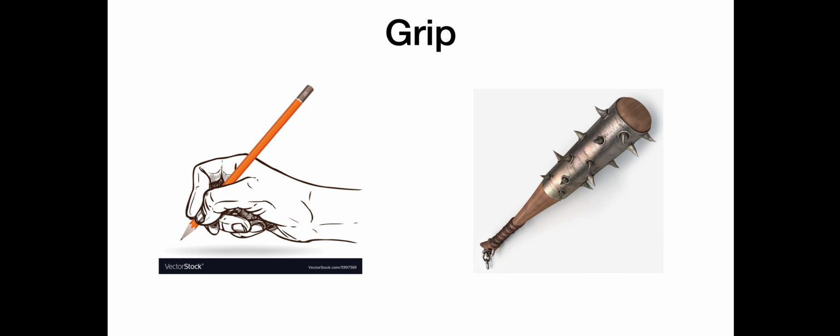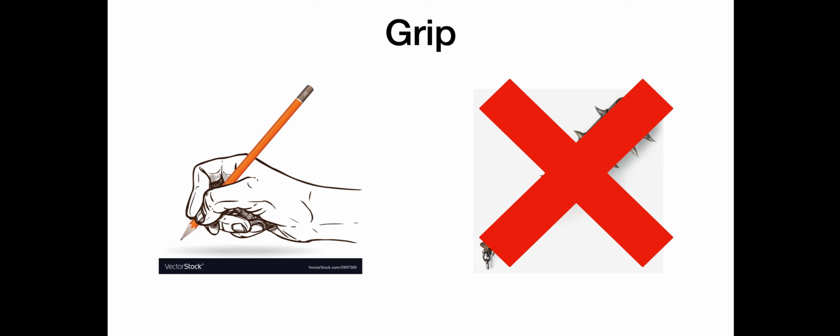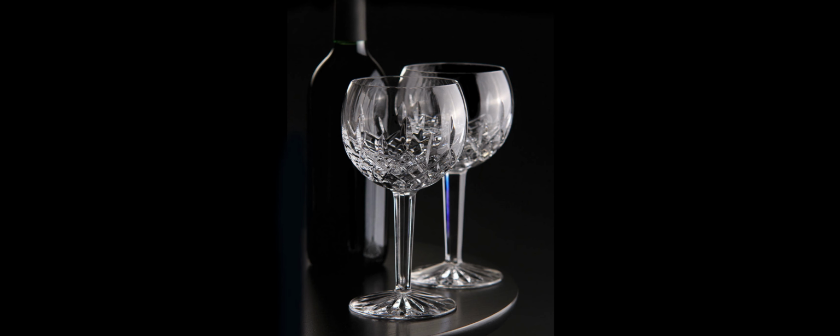When you're holding the transducer, it's much, much better to hold it delicately between your fingers, a little bit like a pencil, so that you can do very fine movements, as windows are sometimes a little bit challenging. Holding it between the palm of your hand in a club-like grip will clearly achieve big things, but not with any finesse, so a club grip's not to be encouraged.